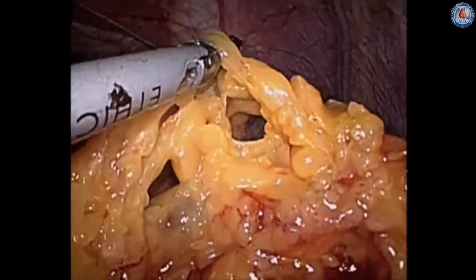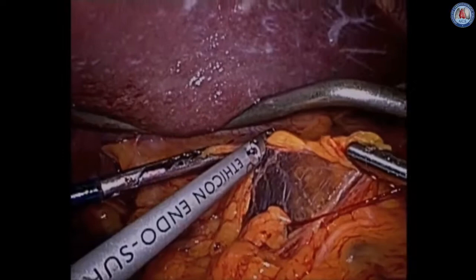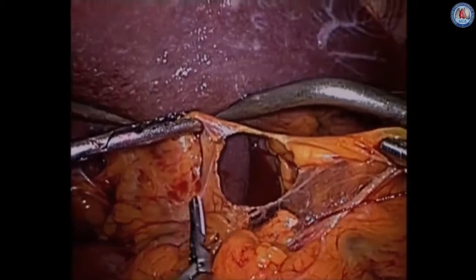As we get up to the short gastrics we get closer to the gastric wall so that we stay fairly close to the stomach. Approaching now the lesser curvature and taking down the gastro-hepatic ligament, working our way up to the right crus.